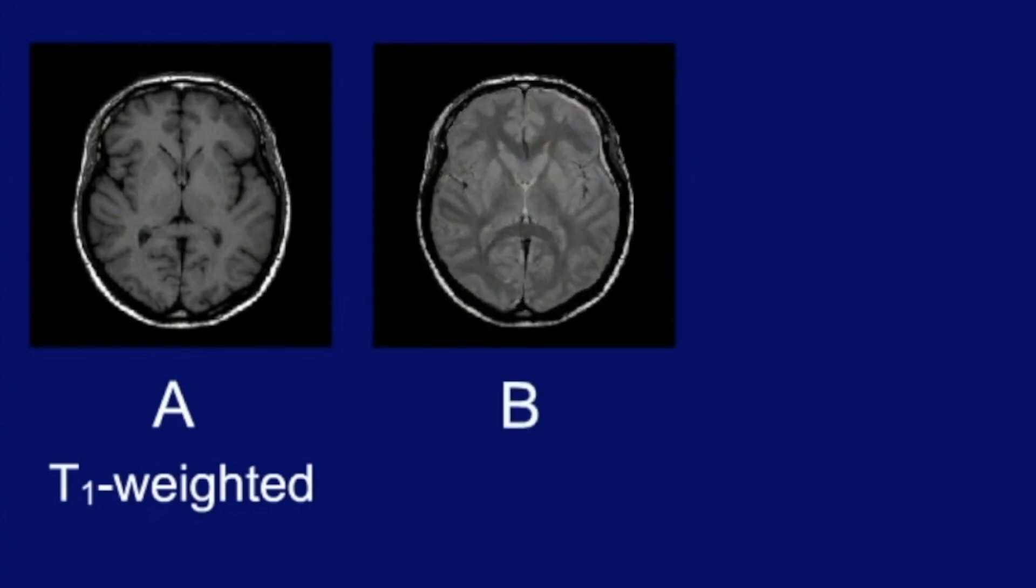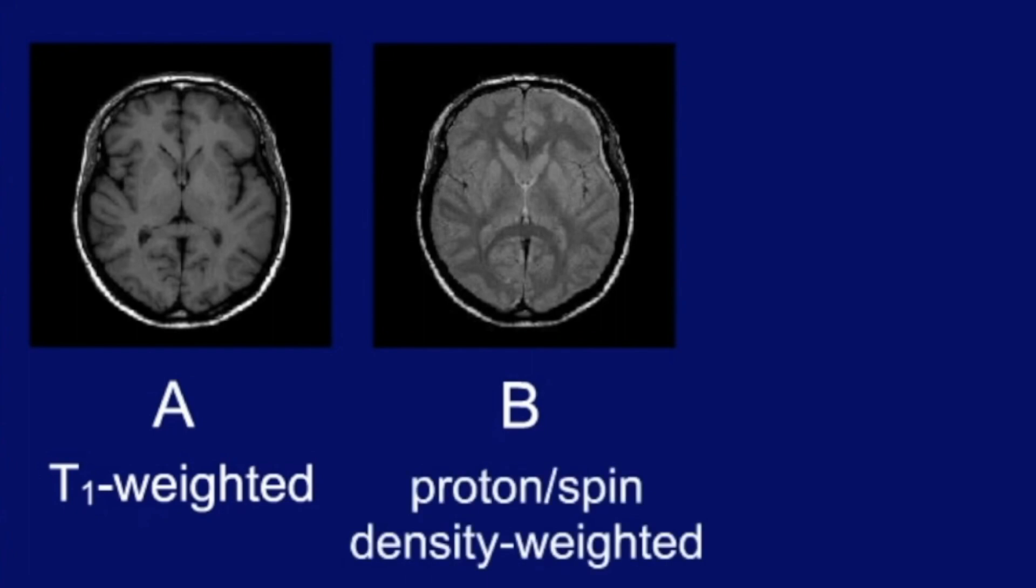In B, CSF is still dark, even though its signal intensity is slightly higher than in the T1 weighted image. Contrast between the grey and white matter is reversed. This is a proton or spin density weighted image. And as grey matter has a higher water content, in other words, contains more protons, its signal intensity is higher than that of the white matter.